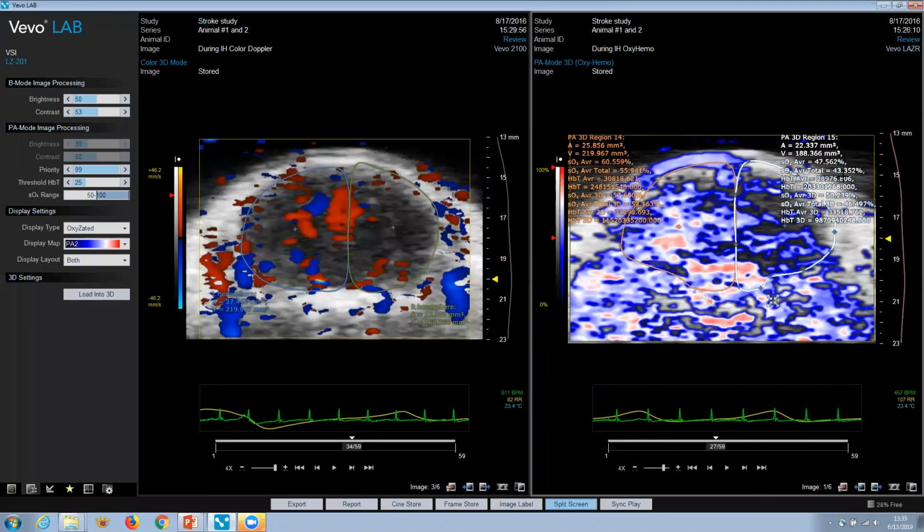And now we have all these different imaging parameters in the oxygen saturation image. So for example, we have all our 2D values for this particular slice, SO2 average. I'll just point that one out in particular. But then you can go down and you have all those 3D values as well. So the SO2 3D in the left hemisphere is 57, sorry, 57, and 50 in the right hemisphere. So we can see already that these are different.